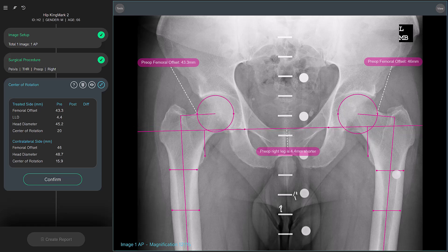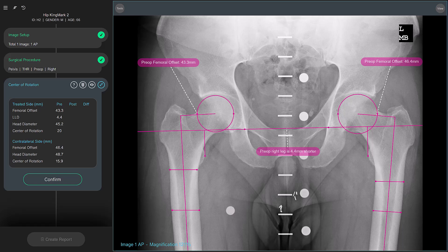Once the cup and stem implants have been added to the plan, the center of rotation tool displays both the pre-operative and the expected post-operative measurements. Make sure you review and adjust their position before you accept the results. When you're happy with the parameters shown on the image and on the center of rotation card, confirm the pre-operative assessment by selecting Confirm.